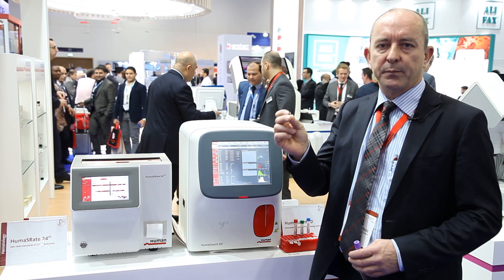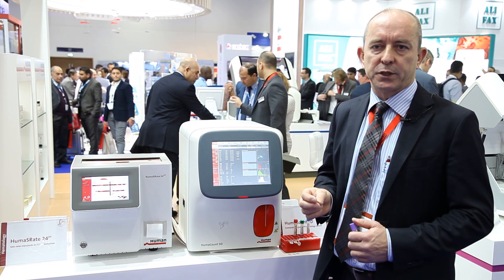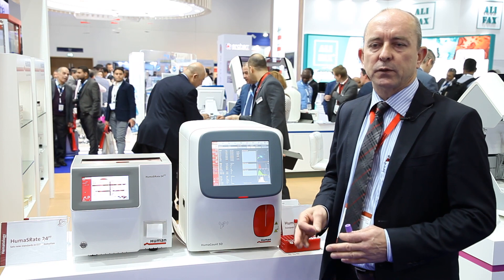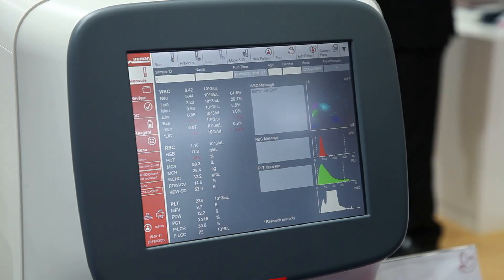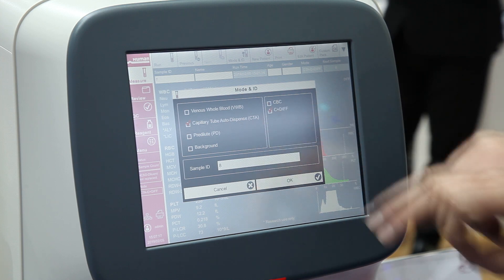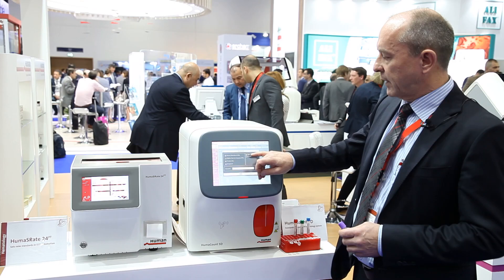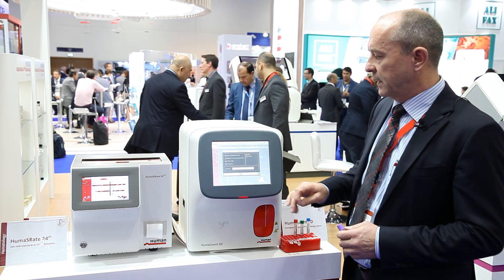Capillary tubes are important to get small volumes, especially for children, and it's very easy on this analyzer to switch between venous samples and capillary samples. If you click here you can run a venous sample; if you click here you have a capillary sample. Both types you can run in CBC mode only or in the full five-part analysis.